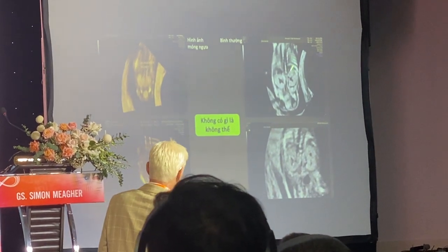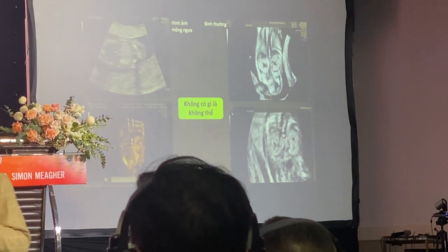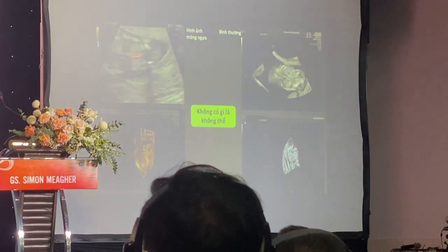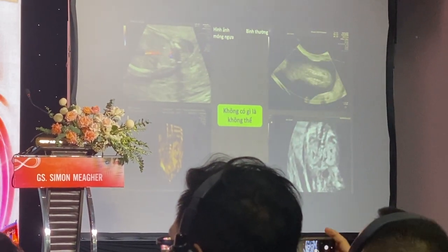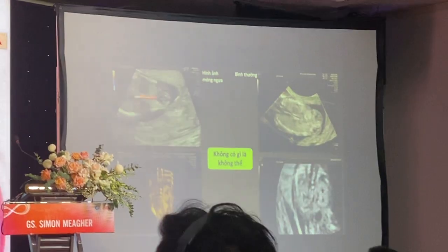This shows an example of normal kidneys. And the first thing you see with normal kidneys at 12 to 13 weeks is they are very bright. They are hyperechoic. Don't make a mistake of calling hyperechogenic kidneys at 12 to 13 weeks, because the kidneys don't filter much urine.